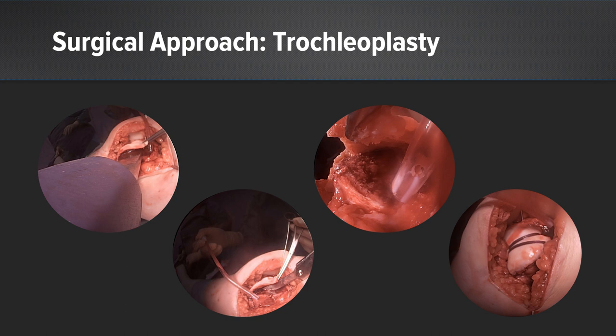we performed via a lateral arthrotomy a typical trochleoplasty, using the technique of Bereiter with a thin flap trochleoplasty. We lateralized the trochlea, removed the supratrochlear bump, and refixed the now concave trochlea using Vicryl bands very effectively. Hereafter, the kneecap showed a very good stability.